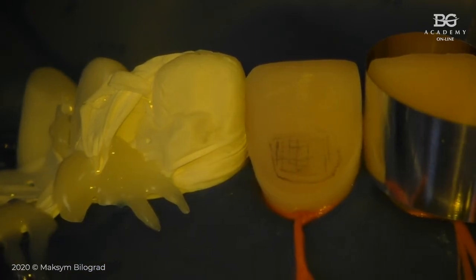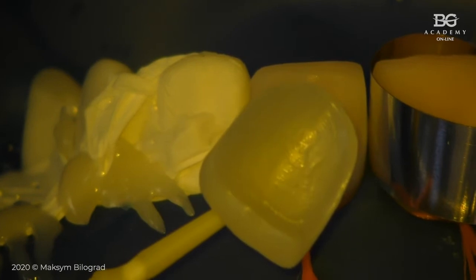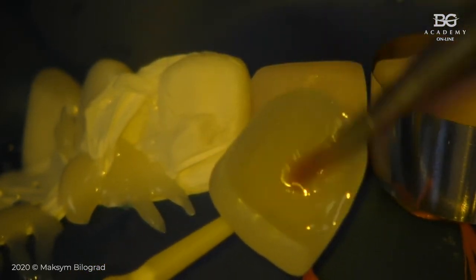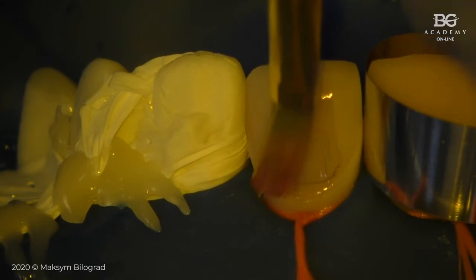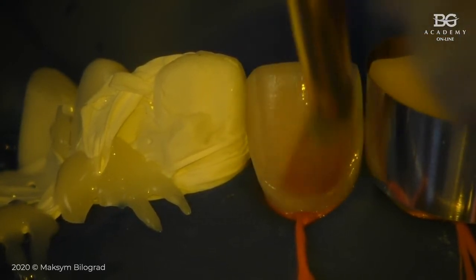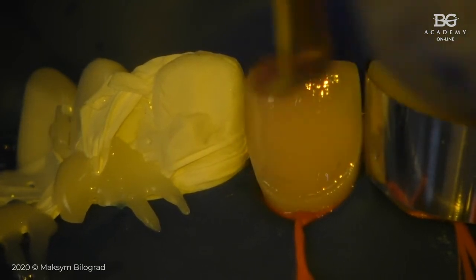Veneer is already silanized, you remember. I will put some bonding agent to the ceramic surface. Okay, and I will put adhesive all over the tooth surface. This is what we have to do.